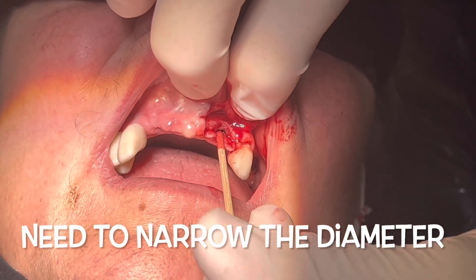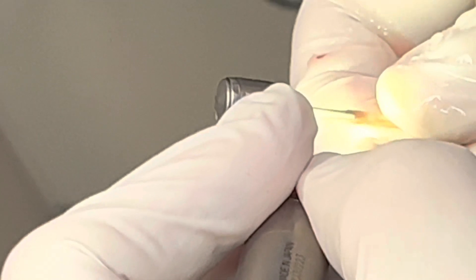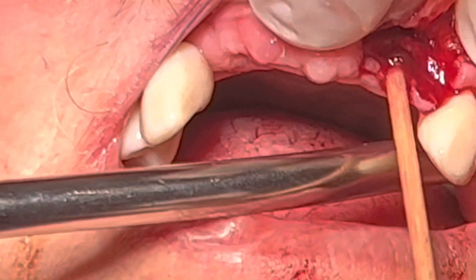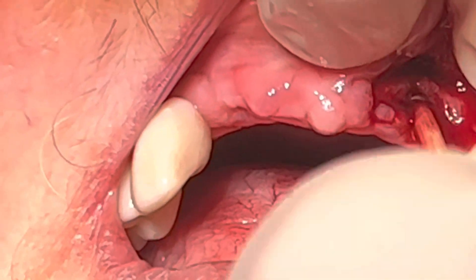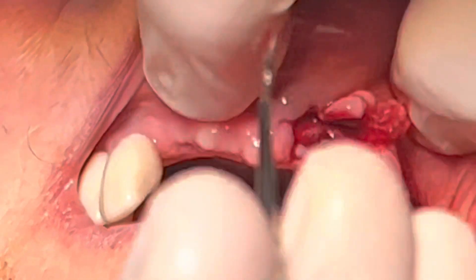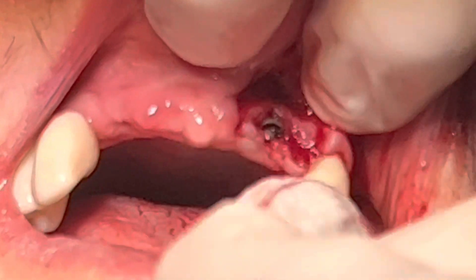We have to narrow the diameter because this little piece of screw is really far up inside the implant. I'll take an 8850 KR diamond and start to make it into a little bit of a spear — not too much — but we need to make it approximately the screw diameter so it can go inside the implant and get to the screw. Then you rotate it; we already have enough moisture here. Do not screw in the wrong direction — righty tighty, lefty loosey — so we're going to rotate it counterclockwise.